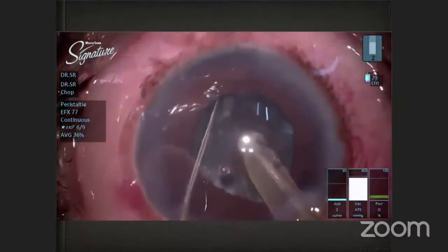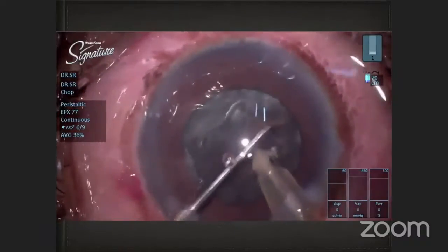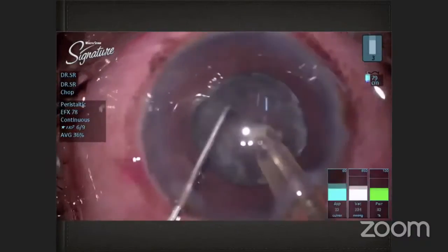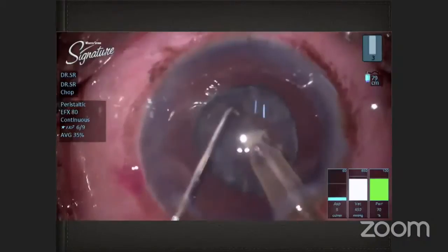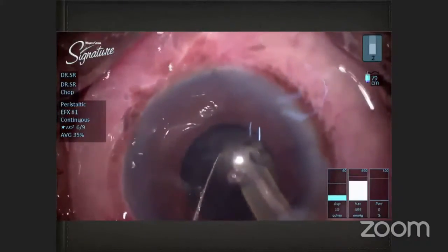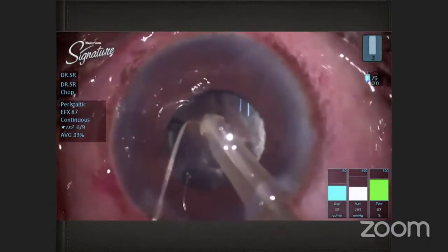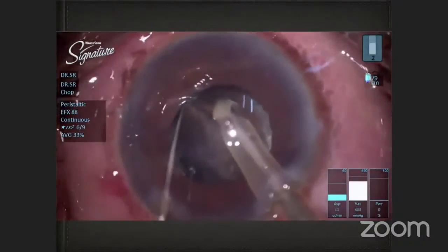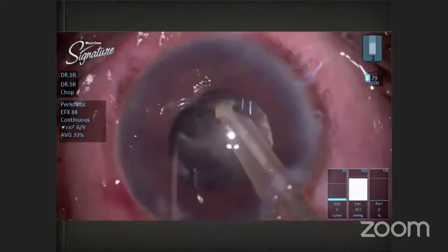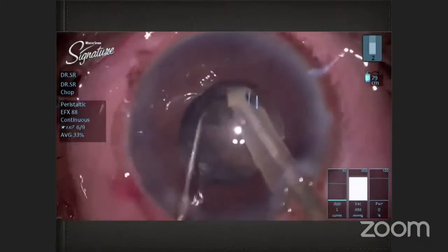Now, as you can see, I go ahead with a horizontal chop, and as I do it, it's only the half nucleus right up to the center which is cracked. I rotate it by another 180 degrees, go ahead, and then complete the chop right up to the center. Now, even when you lose a hold, it's important that you go ahead and grasp it again, and then continue your chopping. You will not be able to chop right up to the very depth, probably in your primary chop in these hard cataracts.